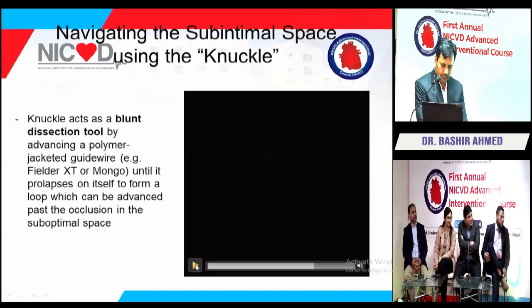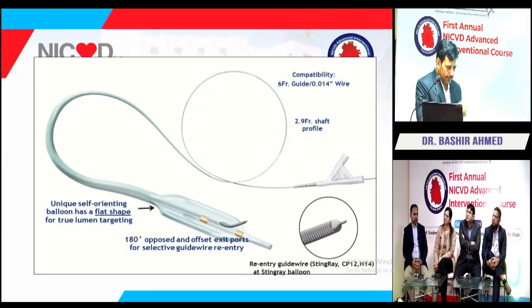Okay, so you see those two golden dots. The way you prep the balloon is, the balloon is only the sides. Where the arrow is, those are sides. So you can think of it as two cylinders.